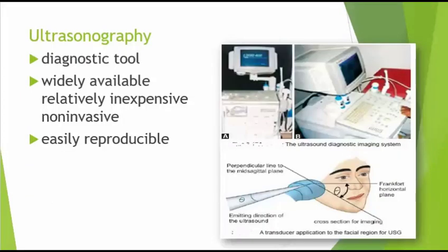Ultrasonography is a diagnostic tool that's widely available, relatively inexpensive, non-invasive, and easily reproducible. It is very sensitive in detecting fluid collection. It can differentiate between a mass and a cystic lesion.